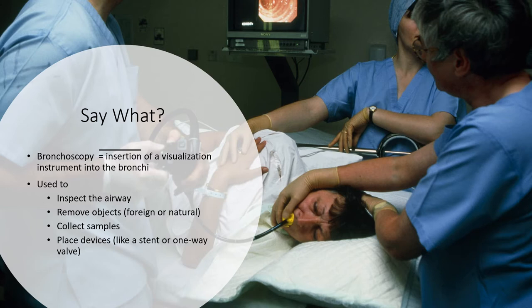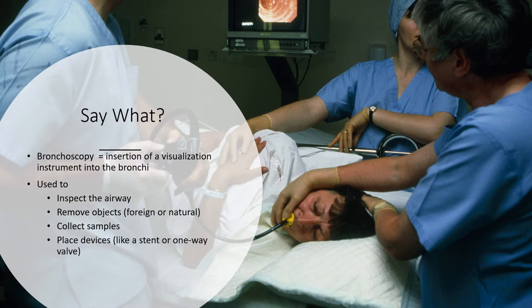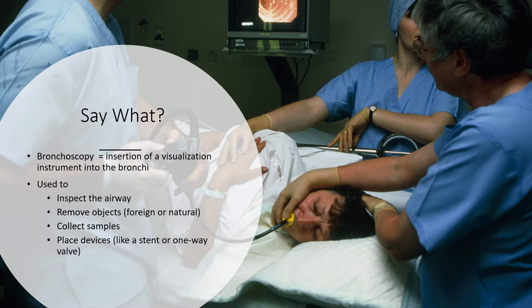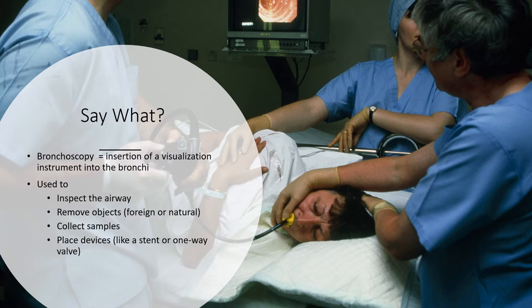We can collect BALs, where we take the edge of the scope and wedge it as far as we can down into, let's say, the right lower lobe. We wedge it down into that bronchi and push 120 mLs of saline, aspirate it, and might only get 30% back. But we aspirate it, and whatever was going on in that right lower lobe that looked weird on the x-ray, we run that BAL fluid — see if it's growing a fungus or something else. That's not something you can usually see on an x-ray.